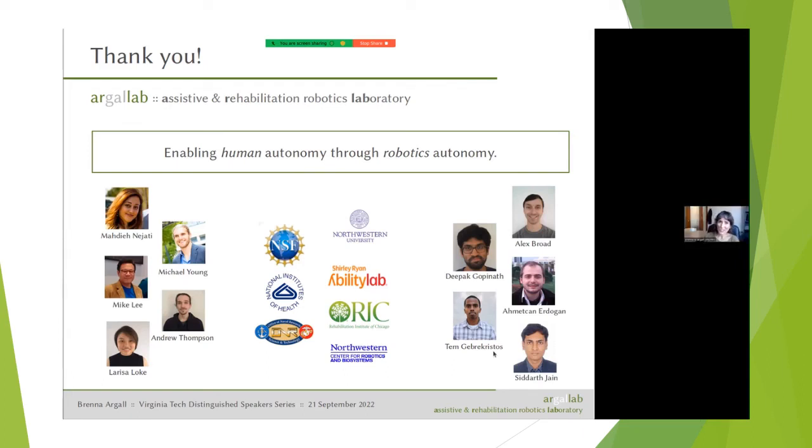Yeah, so it's using a dimensionality reduction algorithm. Sandra's group traditionally had always used PCA, which, in some ways, perhaps sounds like an antiquated machine learning paradigm, but I think it's actually a really elegant solution for this problem because it's extracting the axes of maximal variance, which means that those are actually the axes of maximal movement for the person with limited mobility. They would have them do what they called their calibration dance. So they would move as much as they could, just open-ended. And then from that data set of movement, they would extract these axes of maximal movement.